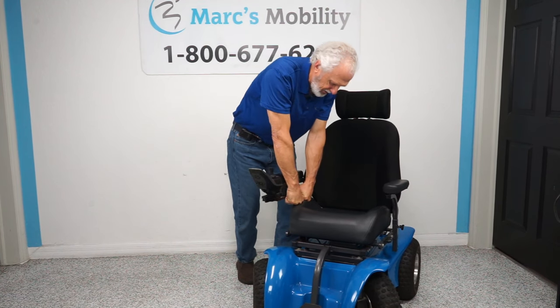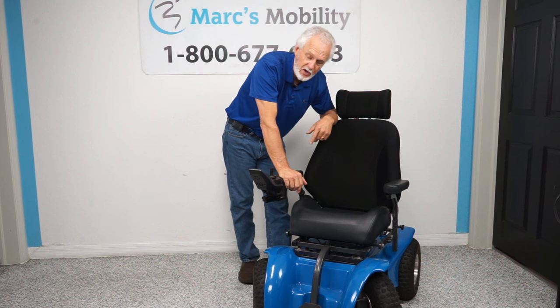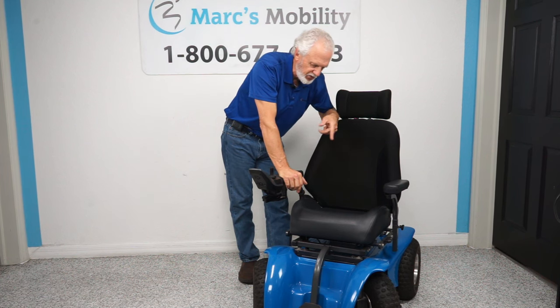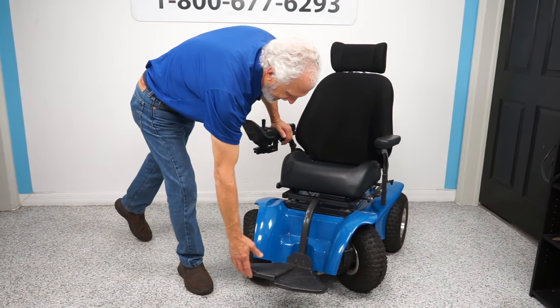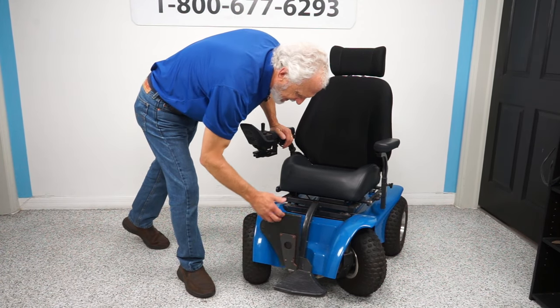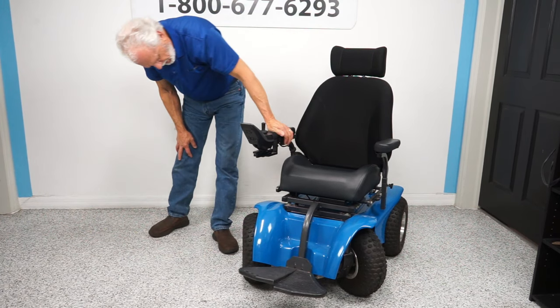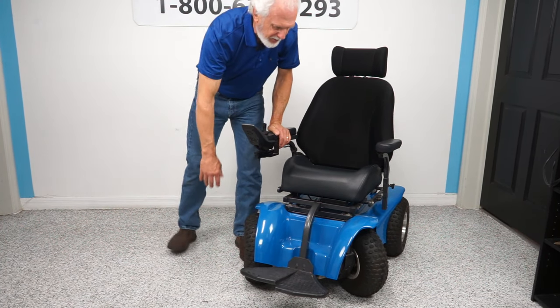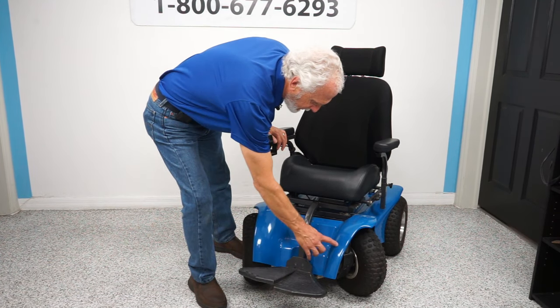If you want a larger seat, we do have a 21 by 20 seat we can put on this chair — we also have a spare seat of 21 by 21. The foot blade flips up when you exit. It probably needs to be moved forward so it doesn't hit the fender and stays up. The whole seating system can be moved forward so the foot blade won't hit the plastic when raised.